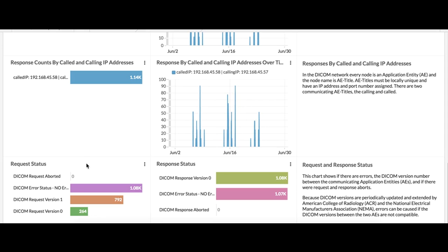The last row on this dashboard shows the request status. The different counts that we see here and the information that we have here helps in troubleshooting, especially when upgrades or new installs happen on a system and then what used to work before just stops working. So this can give us a good idea as to what could be causing problems.